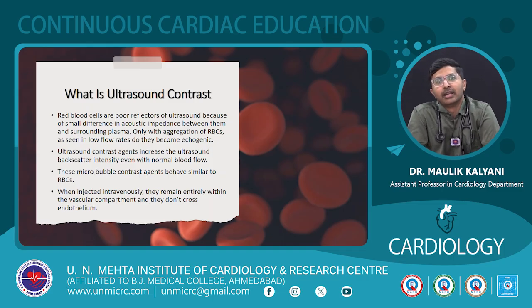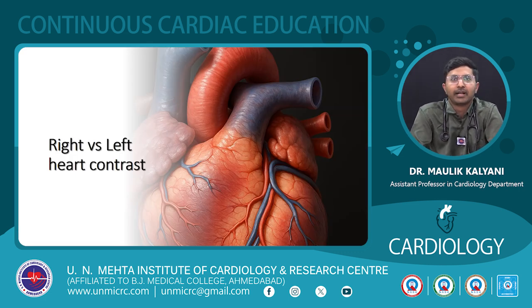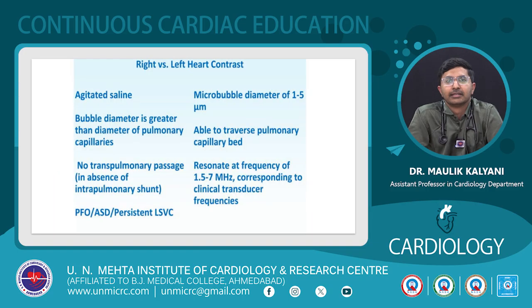These microbubble agents have properties similar to RBCs, and when injected intravenously they remain entirely within the vascular compartment, but they do not cross the endothelium. The topic for discussion is right versus left heart contrast. Right heart contrast we do practically most of the time, and left heart contrast nowadays we generally don't do, and it is mostly for theoretical purposes only.